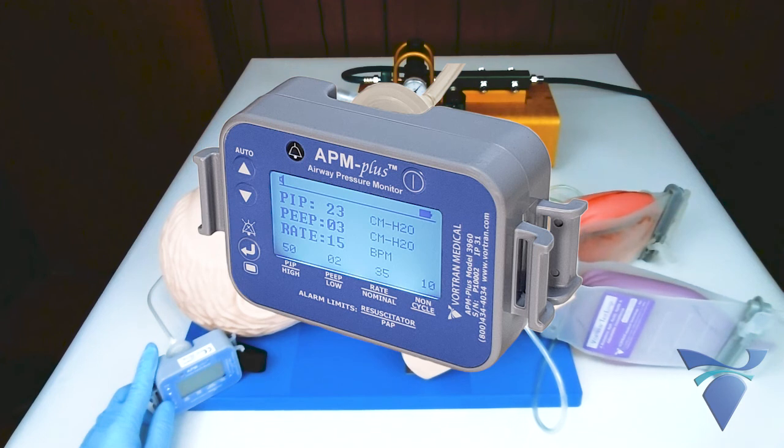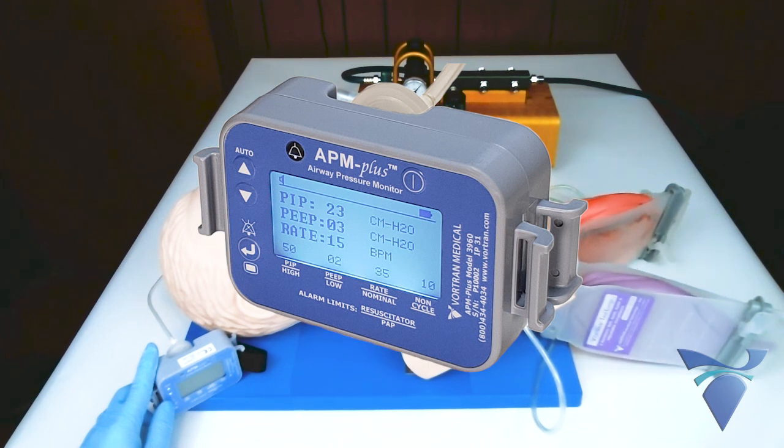Alarms with user-adjustable limits will alert the clinician of high PIP, low PEEP, high breath rate, or a non-cycling condition in case anything in the circuit becomes disconnected.